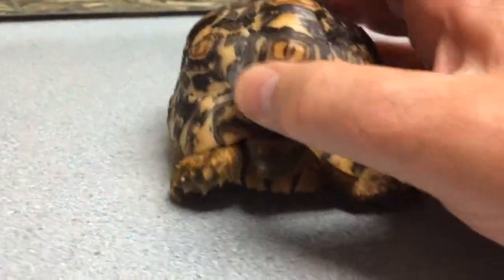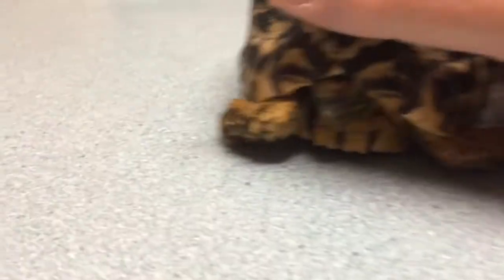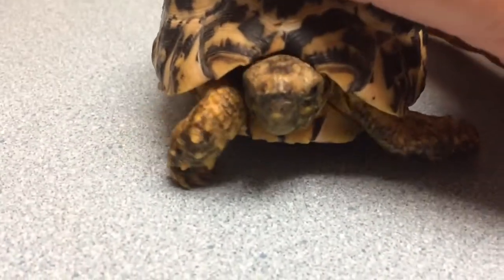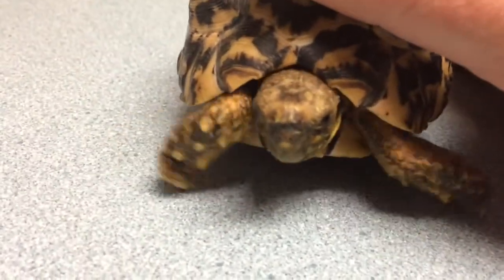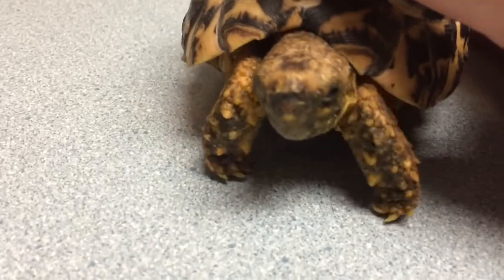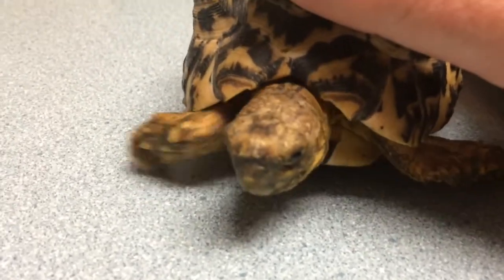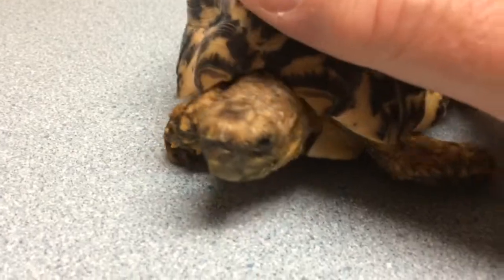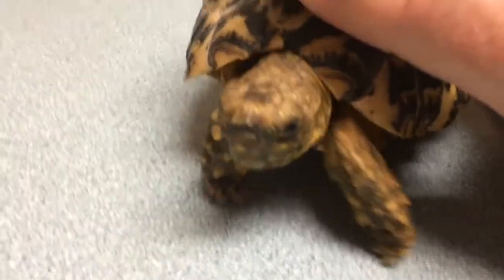This cute little creature came in with signs of sinusitis. They saw some bubbles coming from the nose. I didn't really see any bubbles, but there is some moisture there. I took my slide and gingerly pressed it against his boogers and got some samples, then dried them, stained them, dried them again.